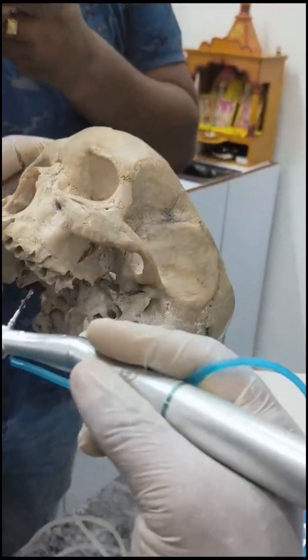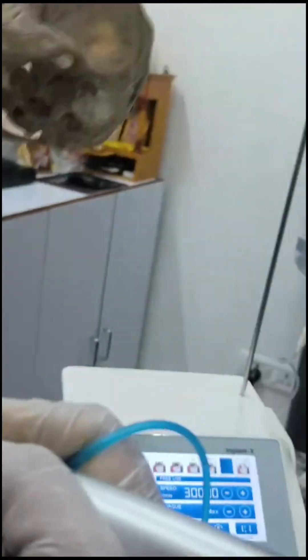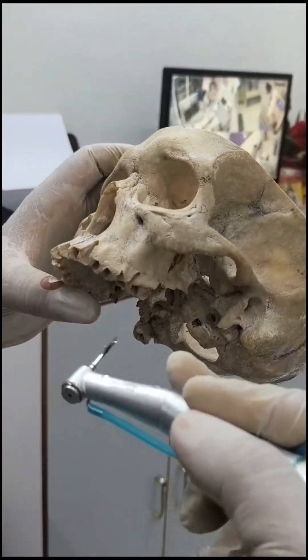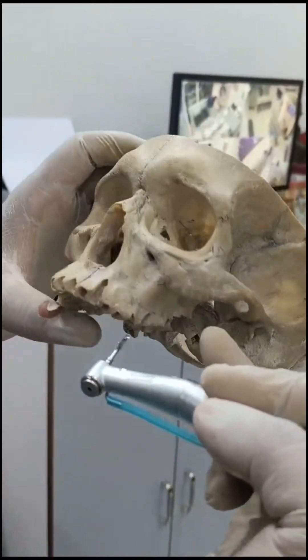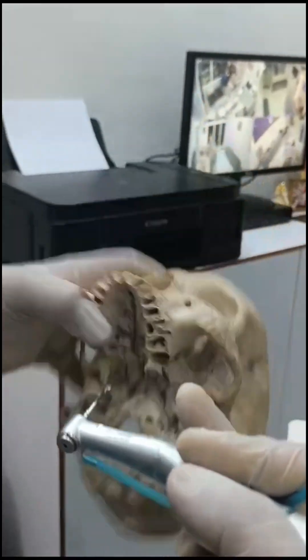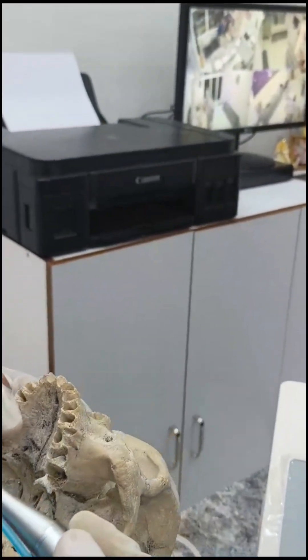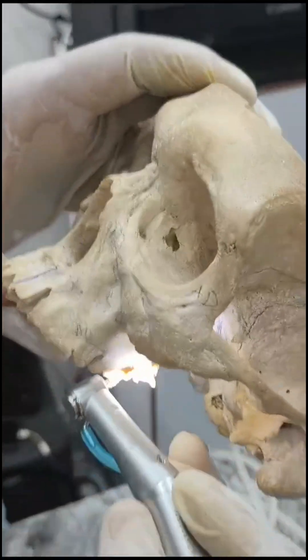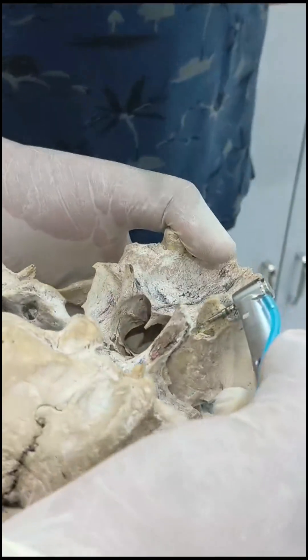Drilling should be performed as follows: we are trying to place the pterygoid implant. We have already achieved our desired area of penetration.